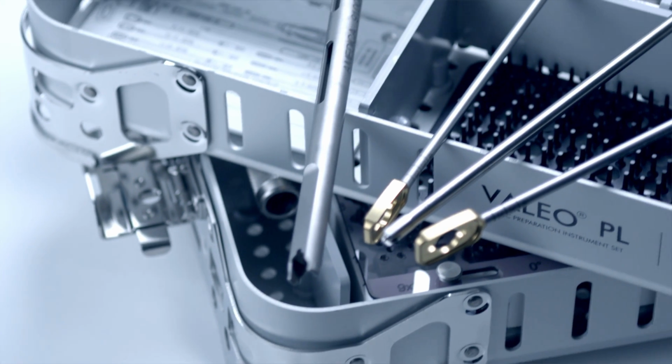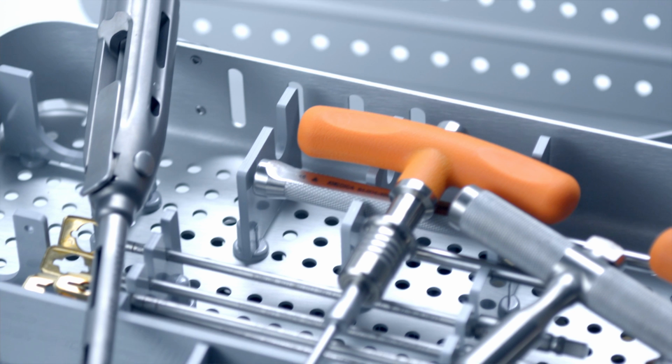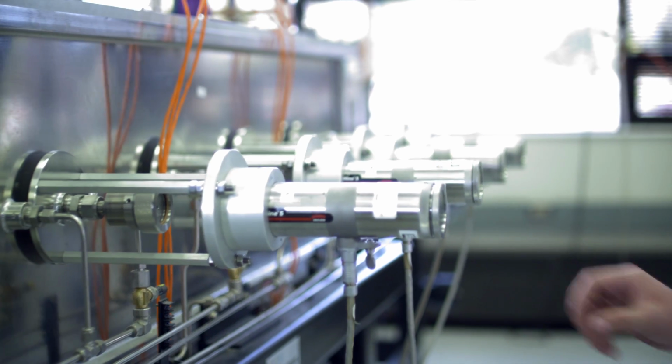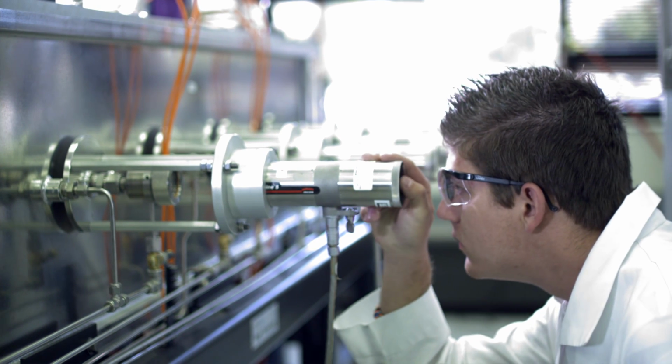Silicon nitride appears to have a lot of the qualities that you would want for clinical success. It has the advantages of surface chemistry, the ability to have bone attached to it, and a similar chemistry and an atomic number to bone. PEEK has none of that. It doesn't have the surface chemistry, and so therefore there's not an attachment by the bone, an osseointegration.